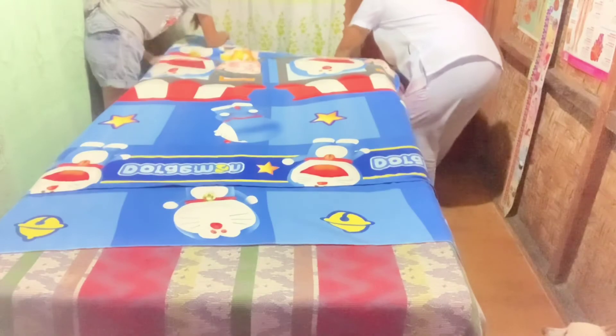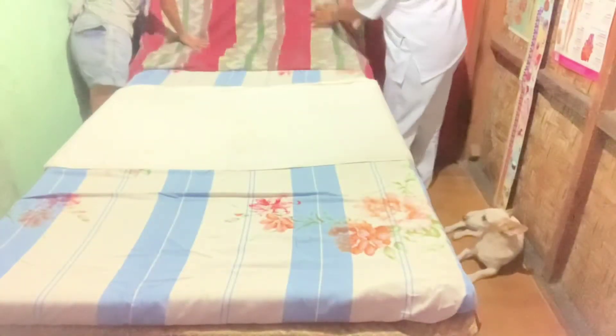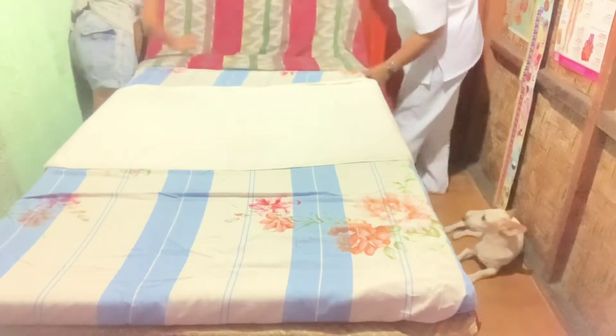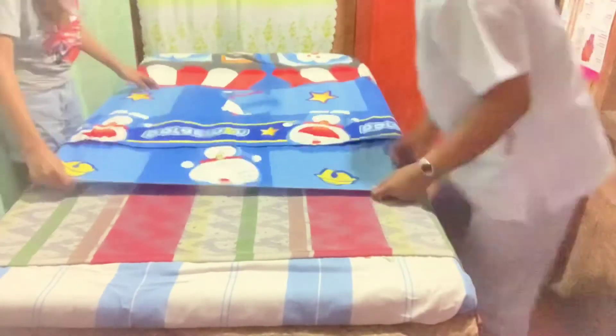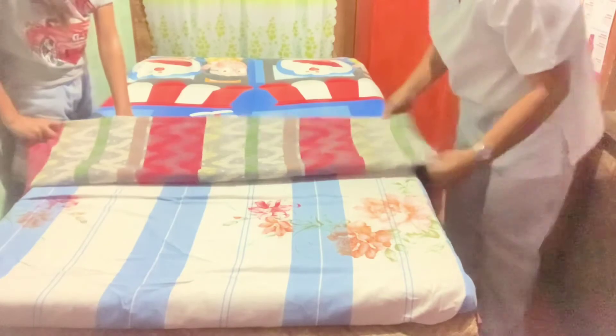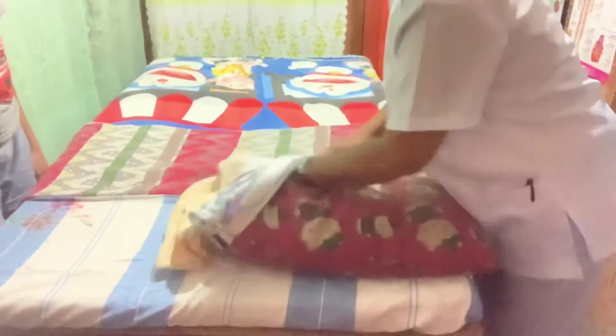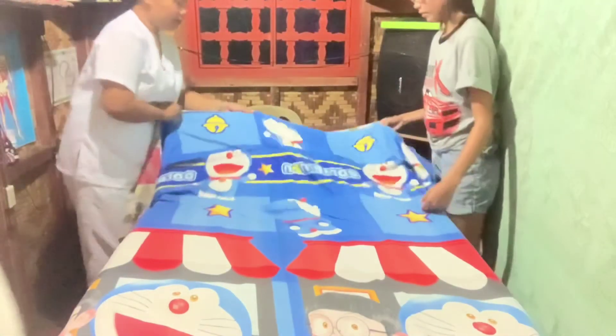Hold the blanket and top sheet together and make a fold at the foot end, then fold back the cuff at the head of the bed with the sheet and blanket. Do fan folding, put a clean pillowcase on the pillow, and place it at the center at the top of the bed. Pull the covers up to the head of the bed.